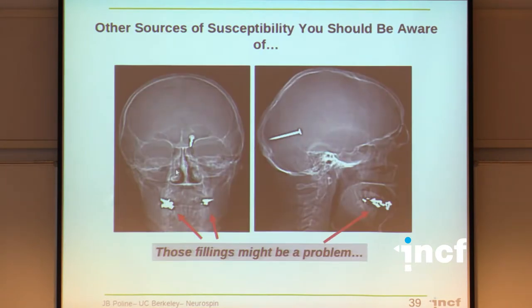One thing you always have to recall is that anything ferromagnetic in the brain is a problem and can be very dangerous. If you have a specific brain like that, you shouldn't put it in the scanner. I don't know how that happened, but there are accidents.